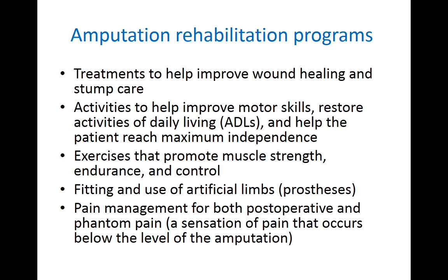After all these things are done, then comes the fitting and the use of artificial limbs, or the prosthesis. Then comes our part, where we take the casting, the measurements, and then we do the fitment of the prosthesis. But during the duration of using a prosthesis, there's always a pain post-operatively, which is a post-operative pain, and there's another pain which is a phantom pain.